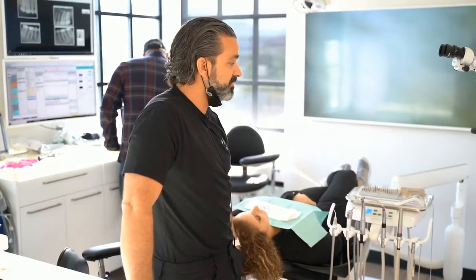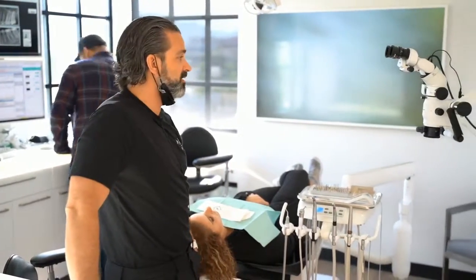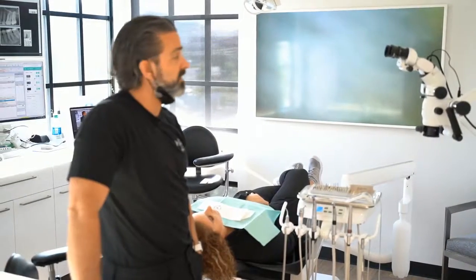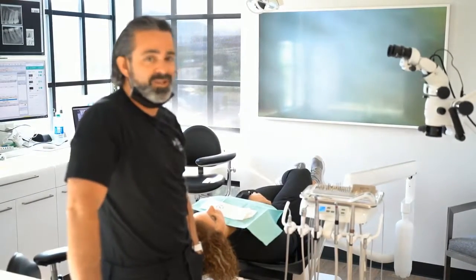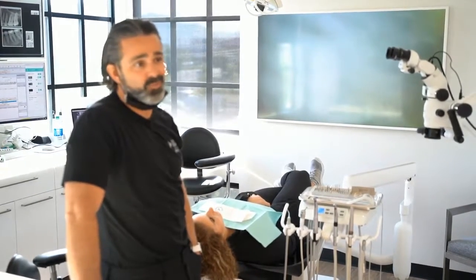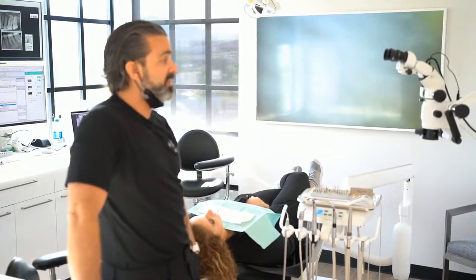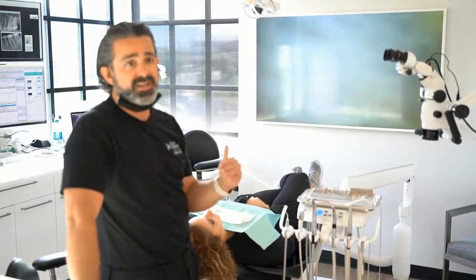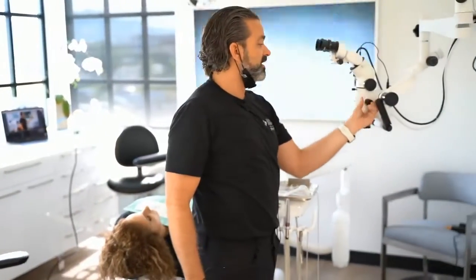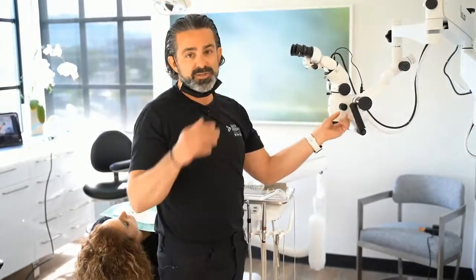Filters, the ability to filter, is a must. You aren't going to want that light on a setting composite. It just shortens your working time. And actually, more than you would think, you don't work at high light power. I work more on a lower power. The more comfortable I get with a microscope, the more I like the range of the steps. This is a 6-step, which is another way of talking about a microscope. Different companies do different configurations.